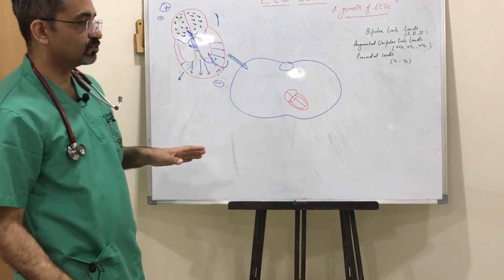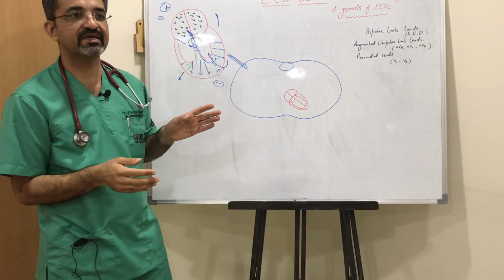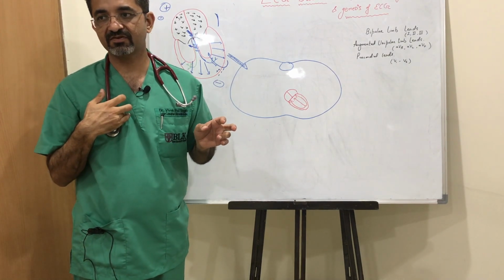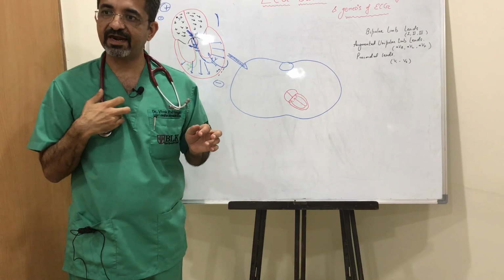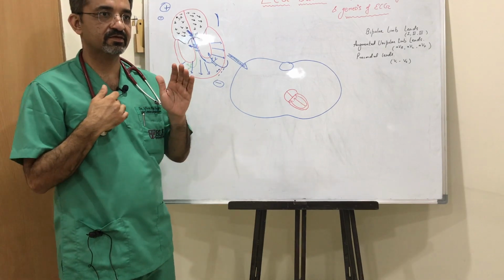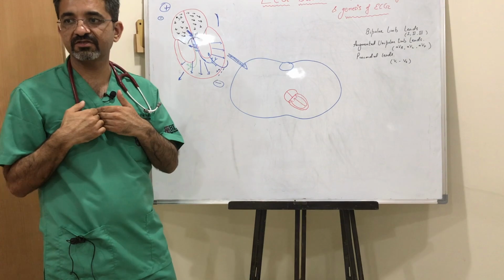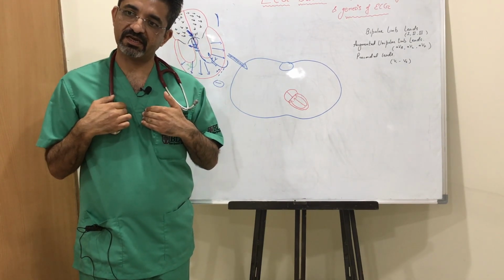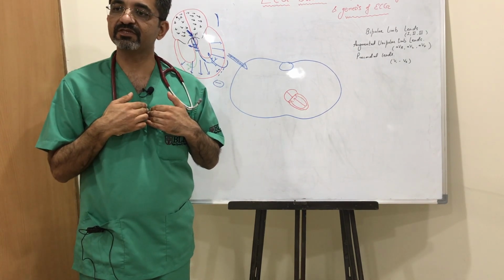So first we need to learn about the placement of V1 to V6 leads. You find your sternal angle, go down 2 ribs, just right 4th intercostal space, just at the side of your sternum, you put your lead V1, right? Left 4th ICS, just adjacent to your sternum, is your lead V2.